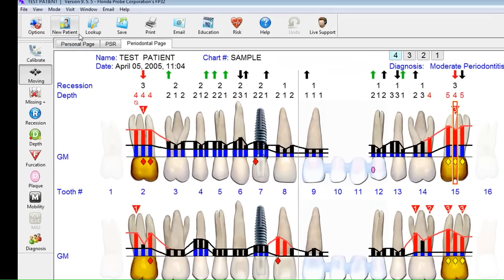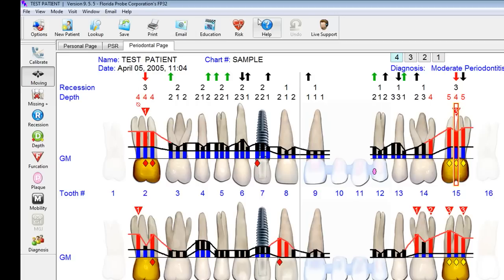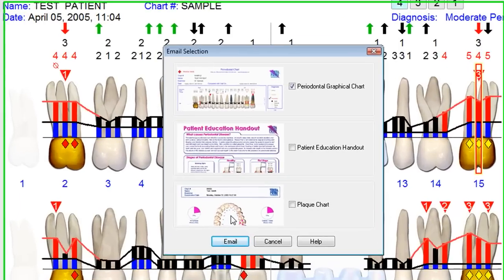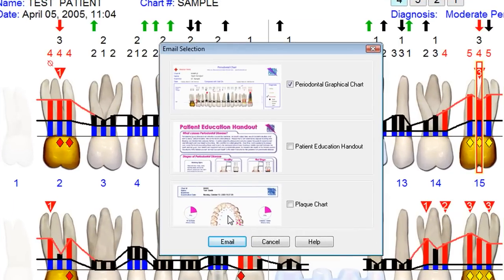I'd like to continue on with the top row of buttons here in the Florida Probe software. The look-up screen allows you to look up any patient of record and print them out at any time. The records are all permanently stored. You can save and print, email a cluster of charts — both a full chart patient education handout and a detailed plaque history for any patient.